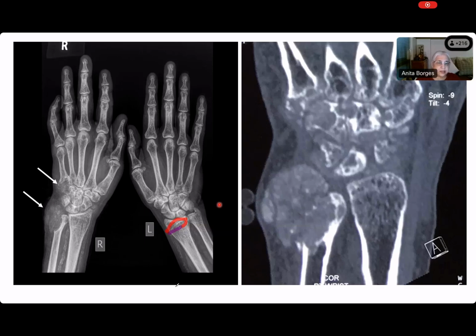How do we know that? Can you tell me how we can know that in the rest of this X-ray? Can you see cartilage in any part of the rest of this X-ray image, whether on the left side or the right side? Is there any cartilage that you can see, Mansi? All right, while Mansi is looking, let me ask Hema. Hema, can you see cartilage? No, ma'am, I don't see any cartilage. Okay. Monica, can you see cartilage anywhere in this whole image, from here to there, anywhere? Pisiform would not have matured.